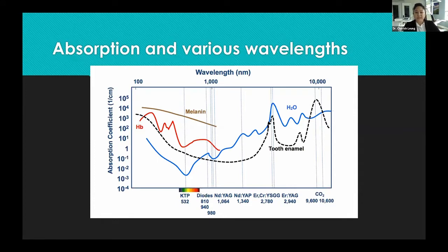If you move on down, you're gonna see the erbium chromium, which is basically what I prefer. That is a laser that I choose to use. That is the Biolase Waterlase is what I use. So that's right here, and its main molecule to work on is water. It also can do hydroxyapatite or tooth enamel. And then if you go later down the spectrum, you can see the CO2 lasers, which basically were initially created for hydroxyapatite. So they're really high on that one and also do water molecules.